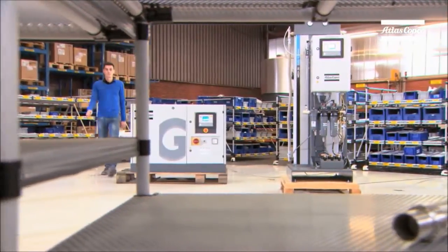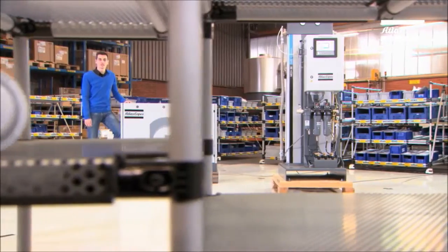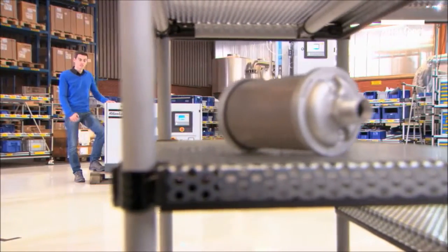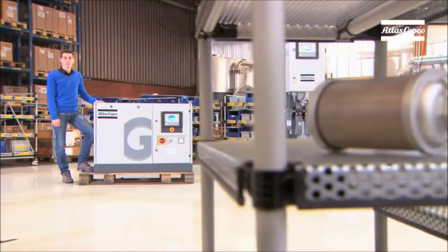Let's start with the compressors. We have used only proven and tested stable technology and components in this medical air plant, such as these GA compressors. This makes this an extremely reliable package.